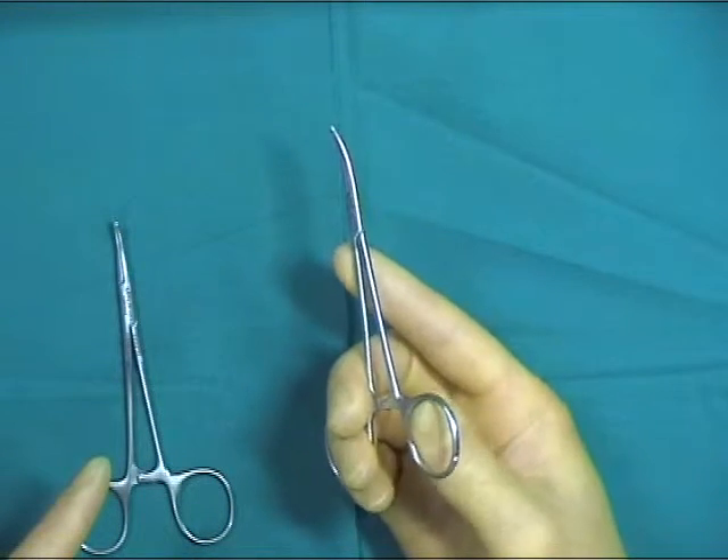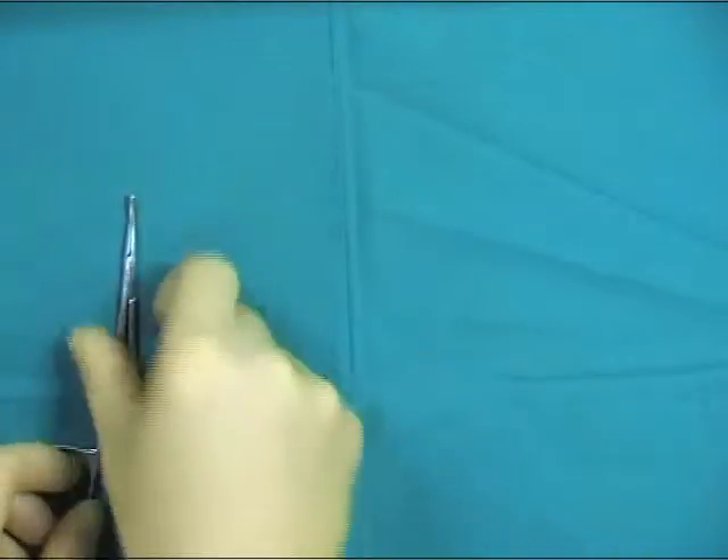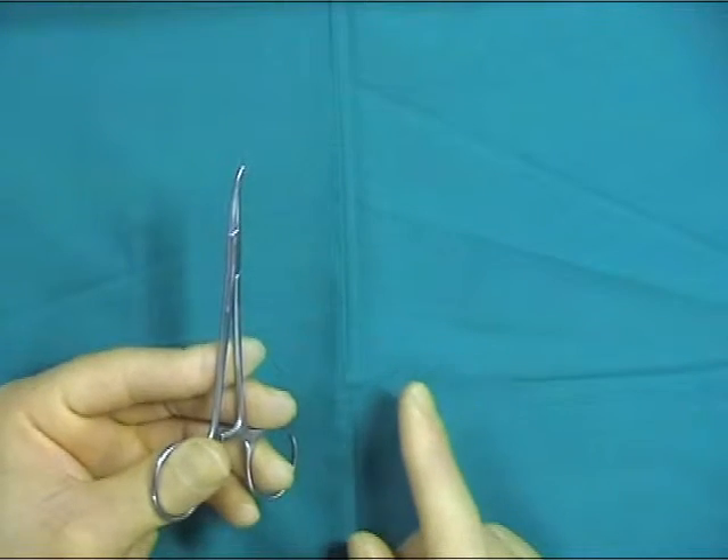All these hemostats are designed for right-handed individuals, and in a similar fashion to scissors, it is quite difficult when held in the left hand to unlock the hemostats, as one intuitively pushes away with the thumb.